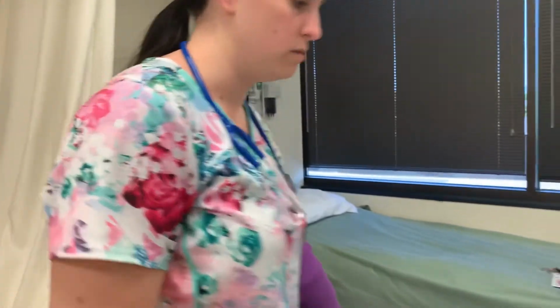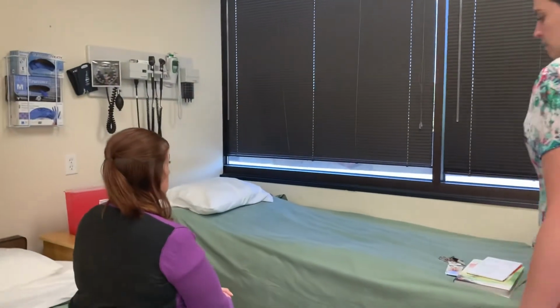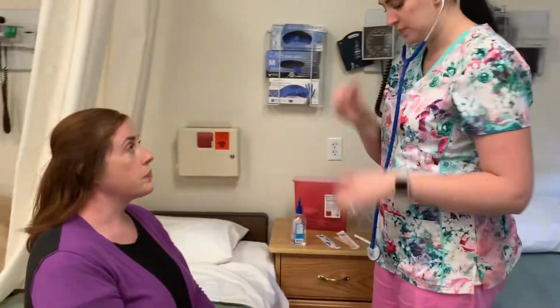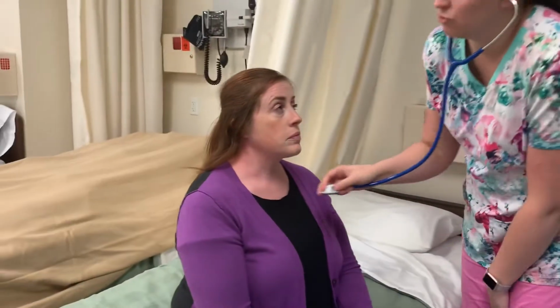So now I'm going to come back around to the front, and I'm going to auscultate anteriorly. So same thing, just take some deep breaths in and out as I move my stethoscope.